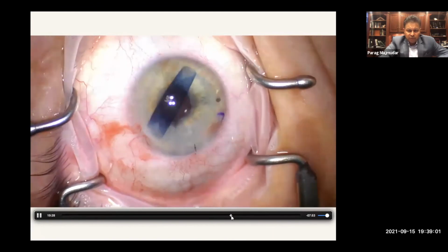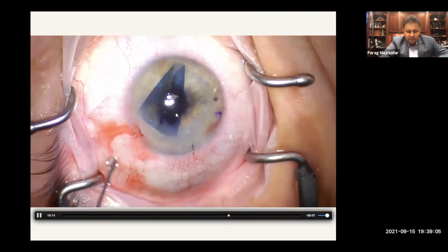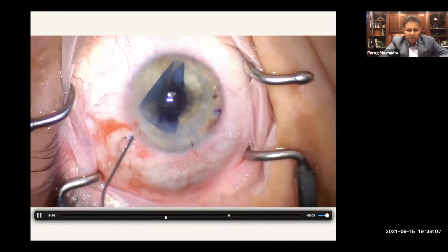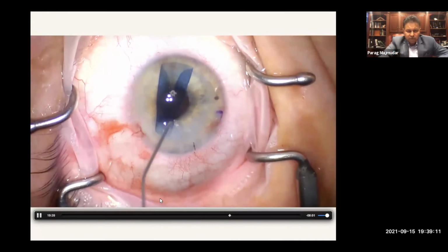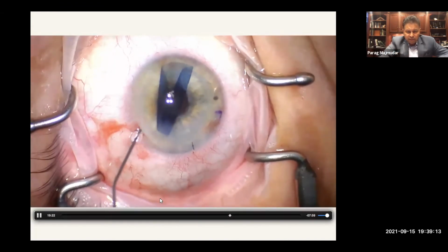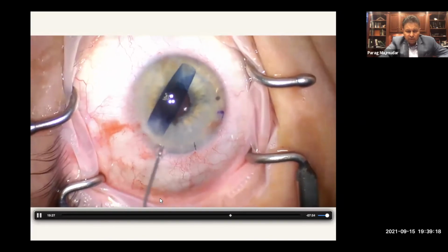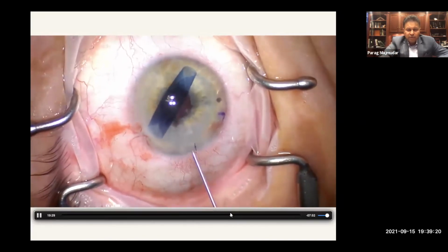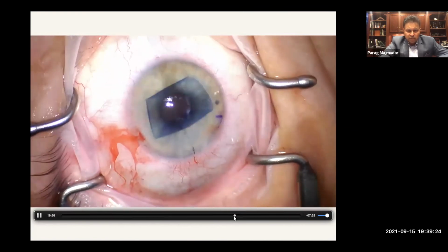I'll just show you that flip maneuver again one last time so you can see here that the stamp is backwards. The graft is upside down, and I'm just using a little bit of burst of fluid to flip it over. Right there, it's still backwards. And I don't know if you can see it, I should slow this down sometime, but you can just see it there, that it just sort of, boom, right there. It just twisted all the way over, and now it's straight. And you can confirm that as you're unfolding it, that you have an S stamp.